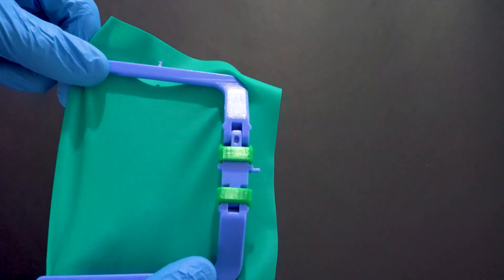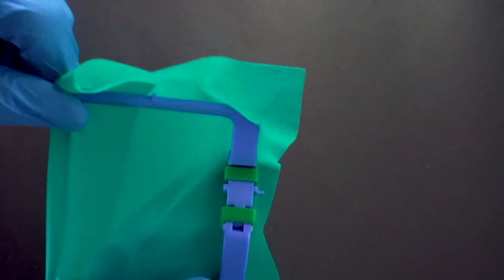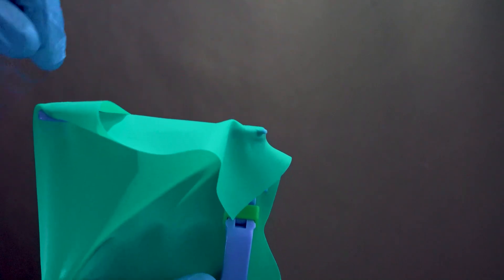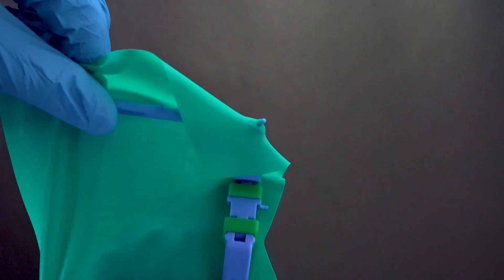Here, the practitioner has locked the side that he is working on and kept the other hinge unlocked. This feature allows the practitioner to keep the tooth isolated while the patient has room to breathe.